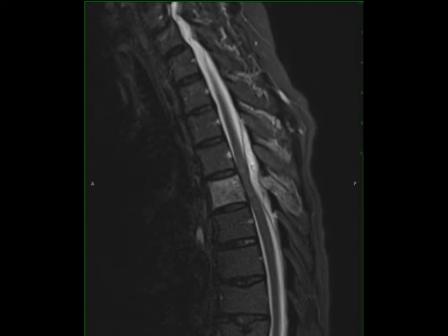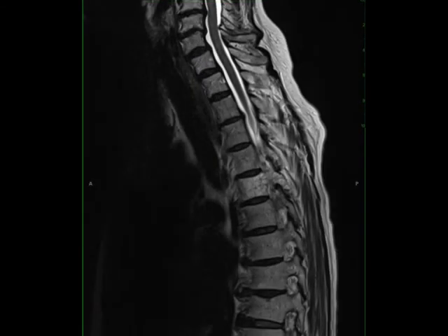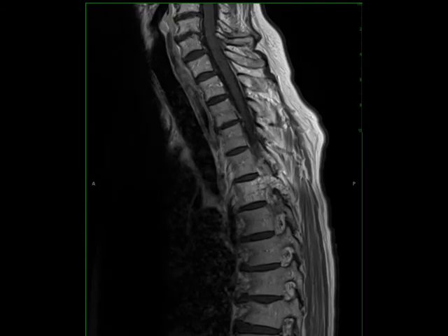The lesion extends into the dorsal epidural space with elevation and displacement of the posterior dural margin, resulting in anterior displacement and partial effacement of the thoracic spinal cord. The deformity of the underlying thoracic spinal cord at that level is best demonstrated on the axial pre- and post-contrast images, where there are lobular margins of the osseous lesion resulting in marked spinal canal stenosis. Findings are compatible with an aggressive hemangioma.